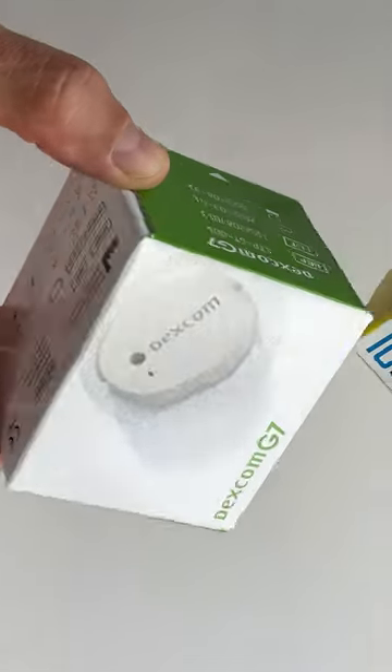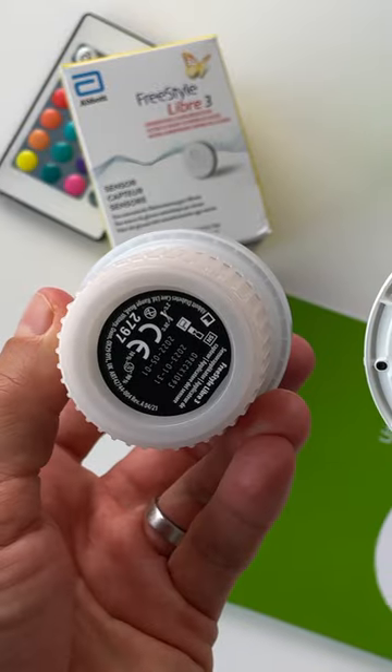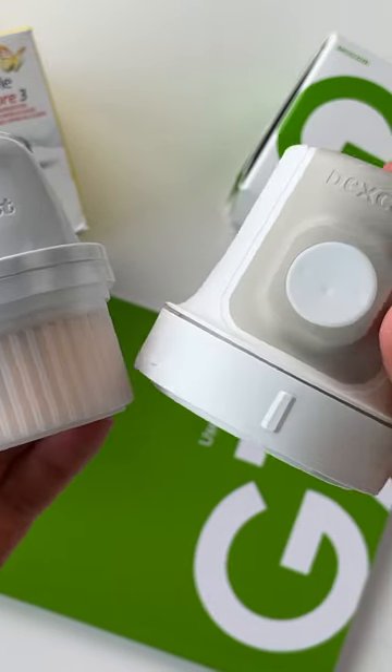Both of these sensors come in very small compact packages. The Libre3 has a slightly smaller box and applicator, but overall the packaging is fairly comparable.